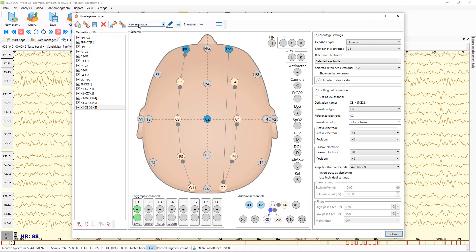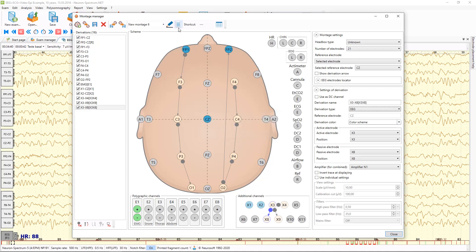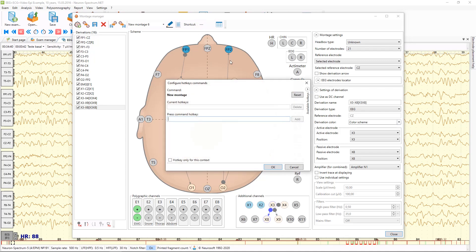Using the toolbar buttons you can save your montage and remove it. You can import and export it to a file. You can rename the montage, sort montages, and set a shortcut for this montage.